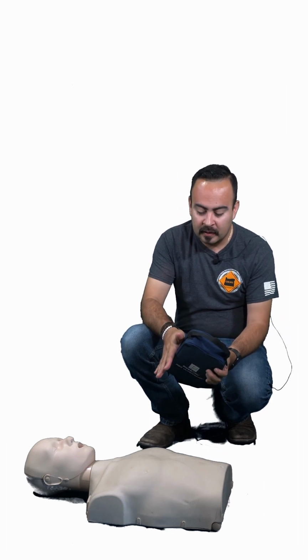Today, we're going to talk about how to run an AED. In last week's video, we talked about how to do CPR. Now we're going to learn to incorporate an AED into the process. AED stands for Automated External Defibrillator.